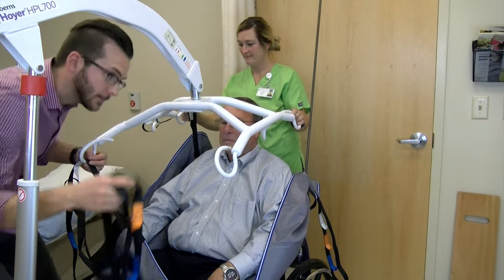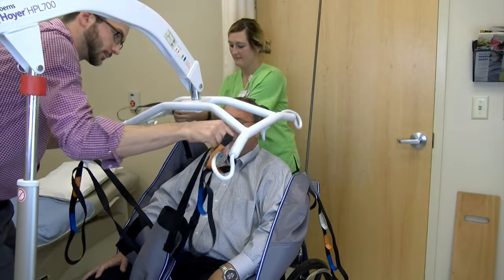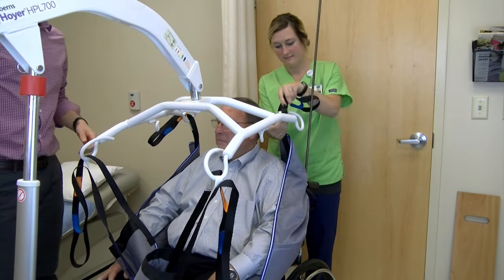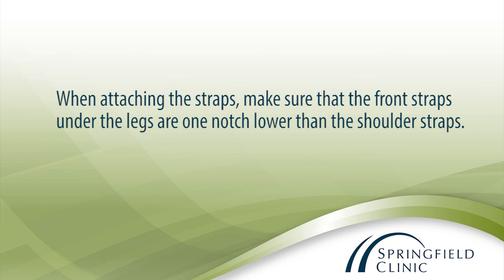Use the same color strap for both legs. Attach the top straps — the ones by the patient's shoulders — to the sling bar, making sure again to use the same color on both sides. When attaching the straps, make sure that the front straps under the legs are one notch lower than the shoulder straps.